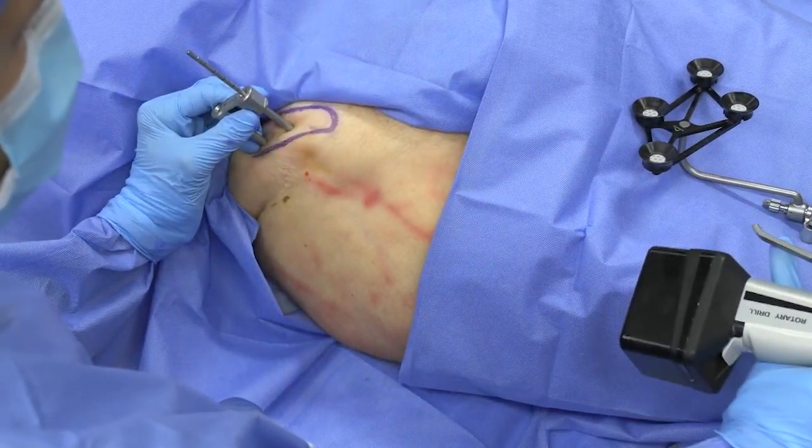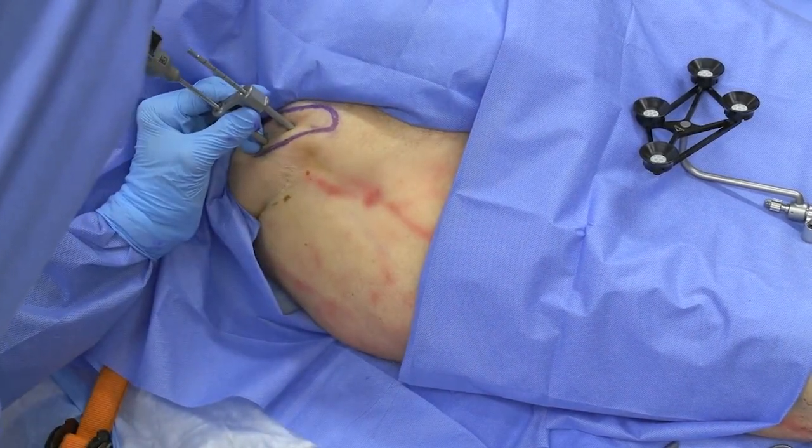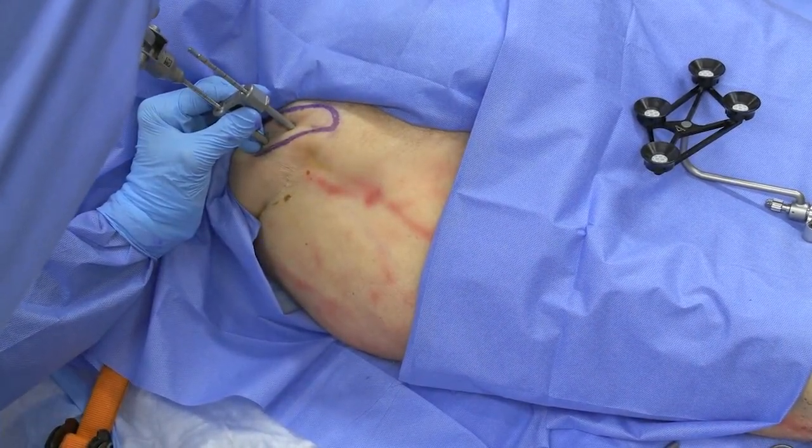And we try to get at least 3 to 4 centimeters of penetration to optimize our fixation.